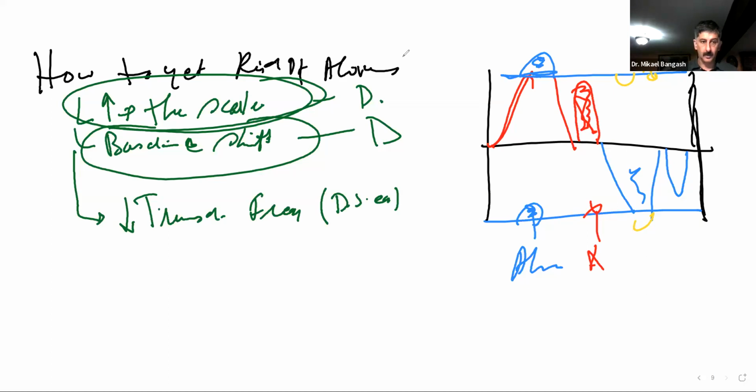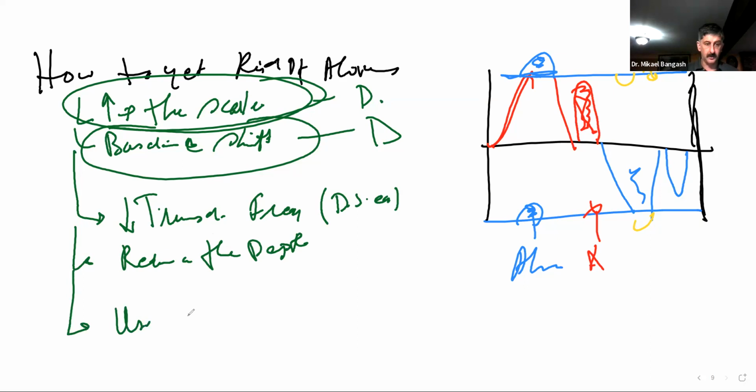Another step that can be taken is to reduce the depth. And last but not the least is to use a continuous wave Doppler.